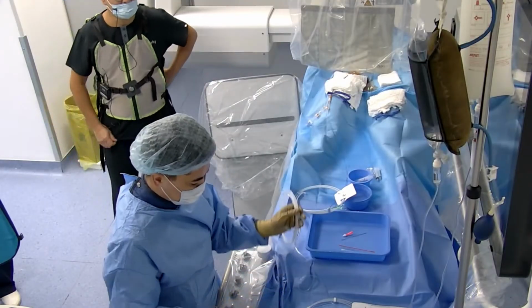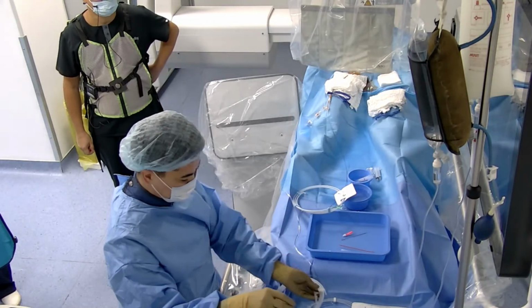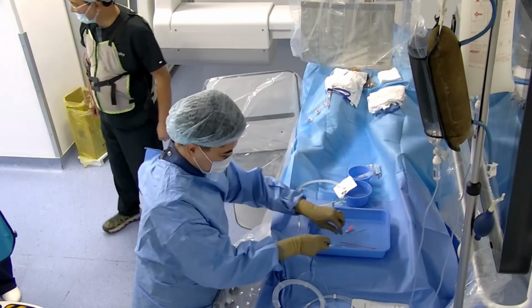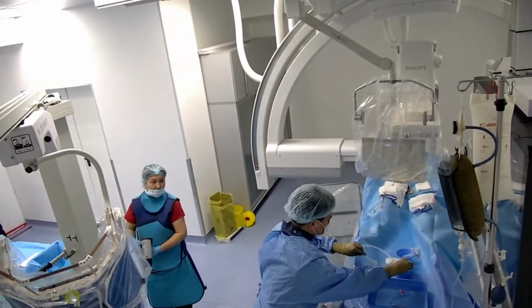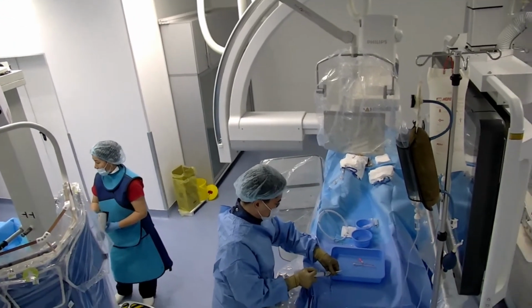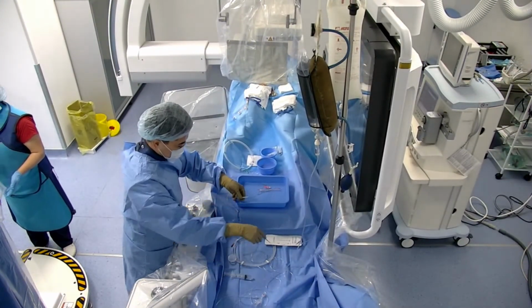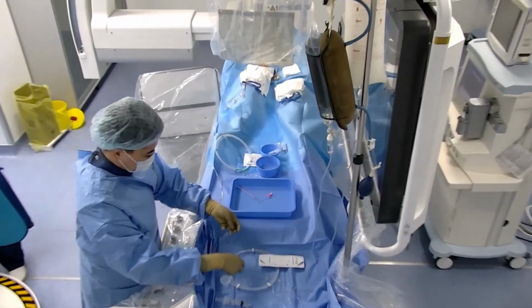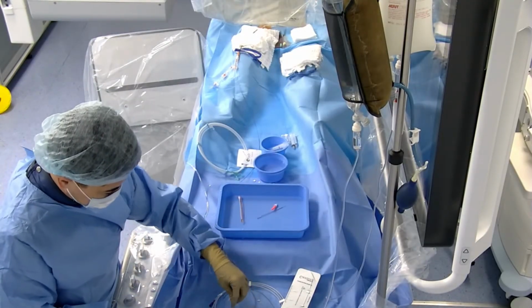After coiling, we will see the possible option to check the territory. If it's just the temporal territory, it's possible to occlude the branch. This territory usually has good collaterals. And for the basilar, we will do balloon-assisted coiling also.